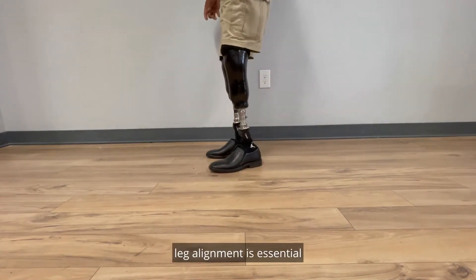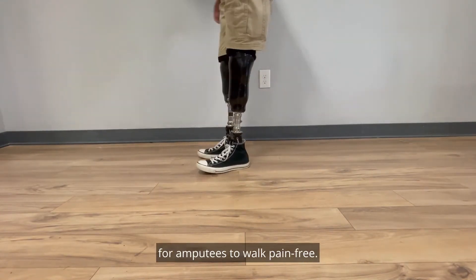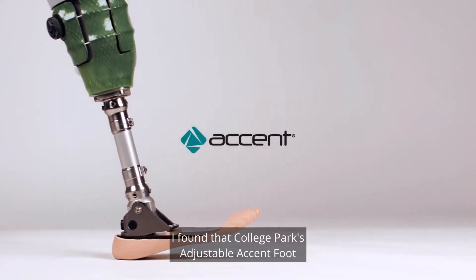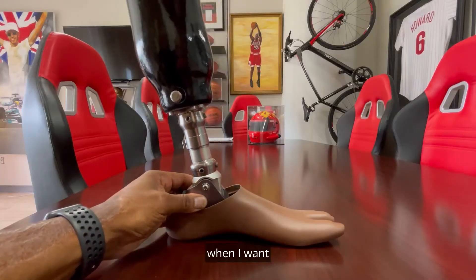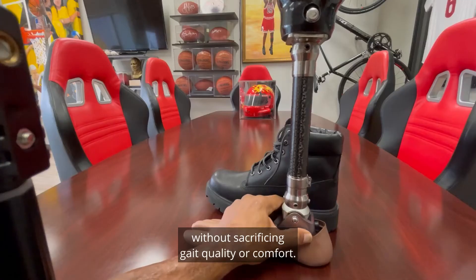As you may know, leg alignment is essential for amputees to walk pain-free. I've found that College Park's adjustable Accent foot gives me the freedom to wear what I want, when I want, without sacrificing gait quality or comfort.